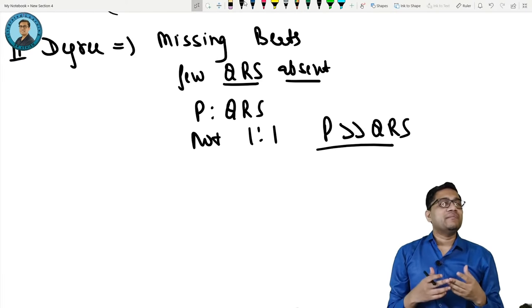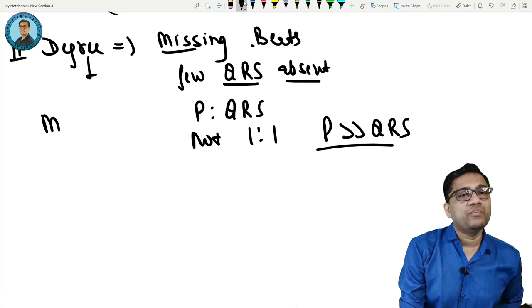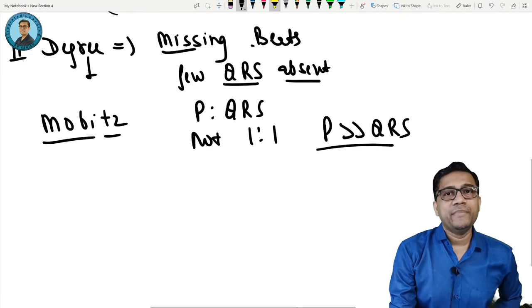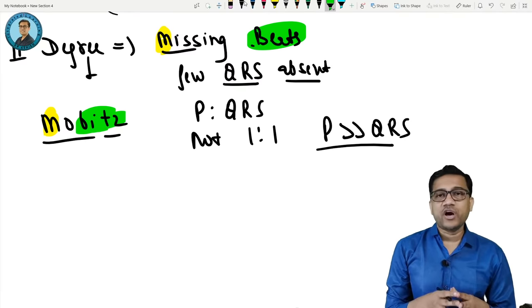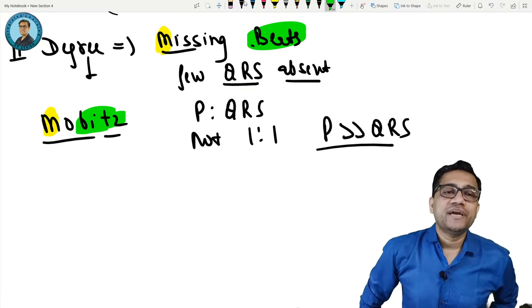The beats are missing. Missing beats. So how to remember the name? Missing beats, Mobitz. M bits is missing beats. Now will you remember the name? So if beats are missing, it is which phenomenon? Yes, second degree. So what is Mobitz? It is missing beats.